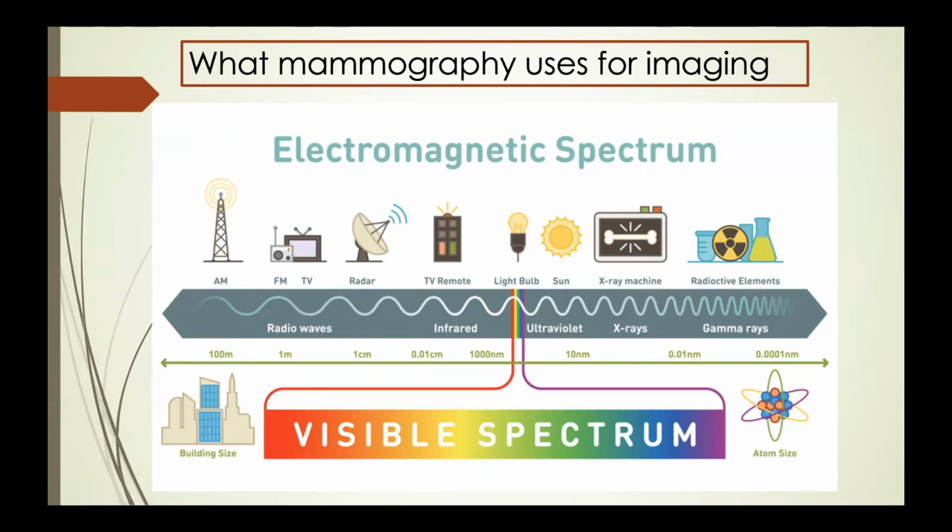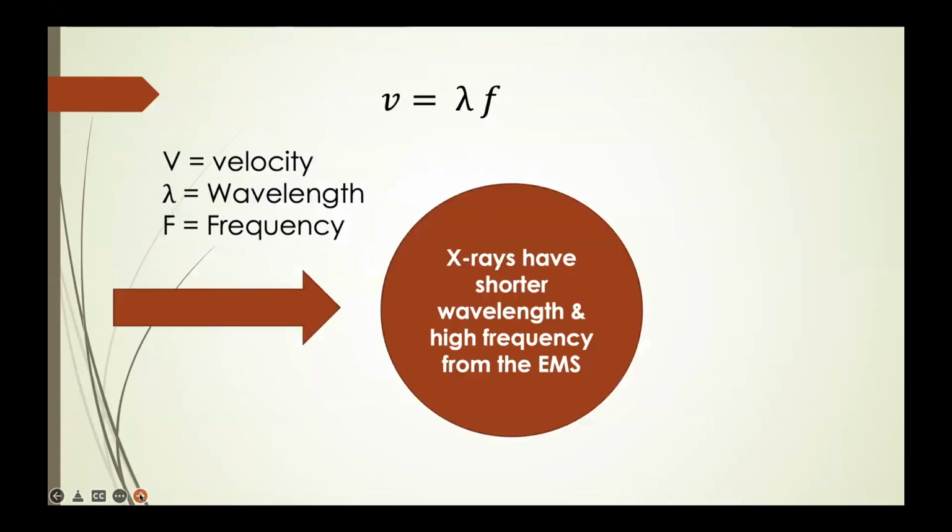The energy of the X-rays is high enough to penetrate the body. We actually want these X-rays to penetrate the body and get us an image. So yes, we classify them as ionizing radiation. The energy is high enough to eject an electron from its atom.